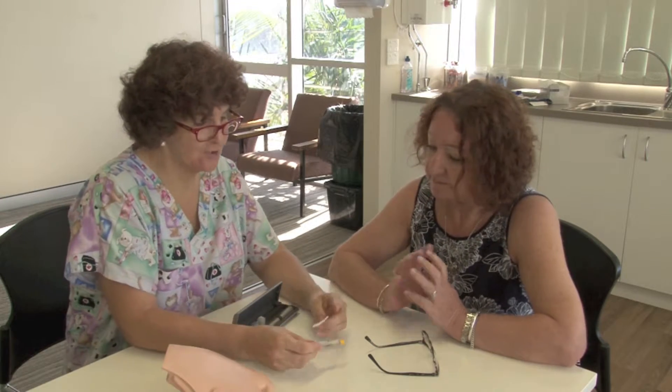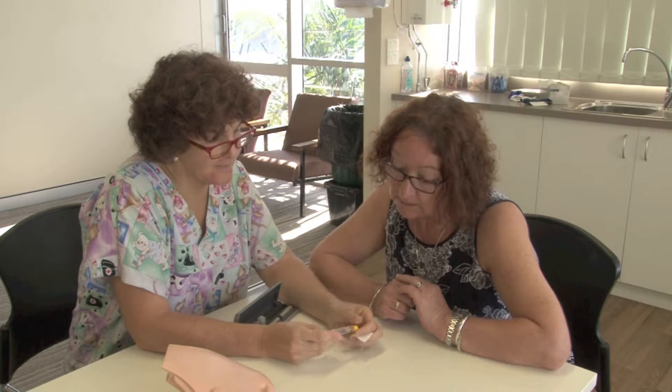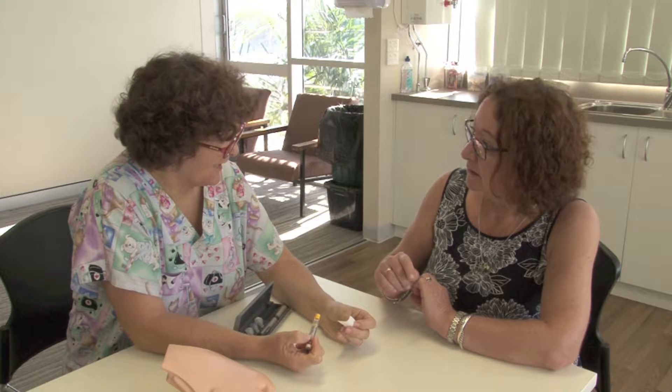So what we're going to do is make sure that we've got the right insulin — the one that the doctors ordered for you. You just need to check the expiry date on it. So if it's a little bit expired, is that okay? No, once it's expired you'll need to throw it out.